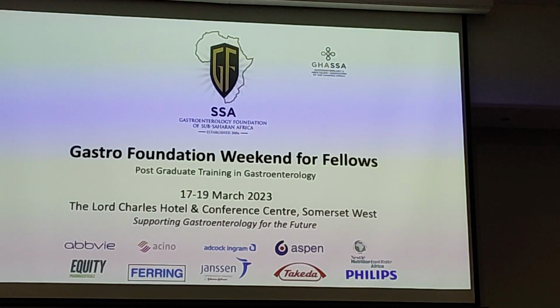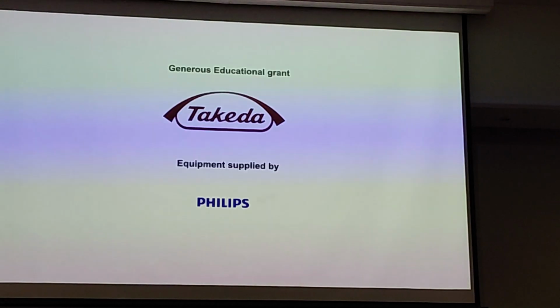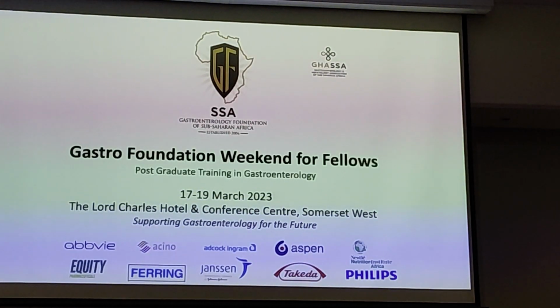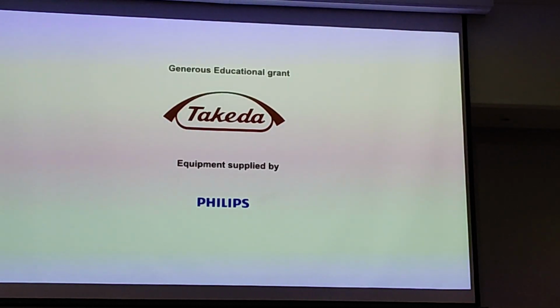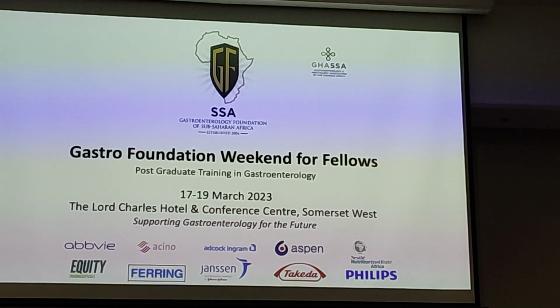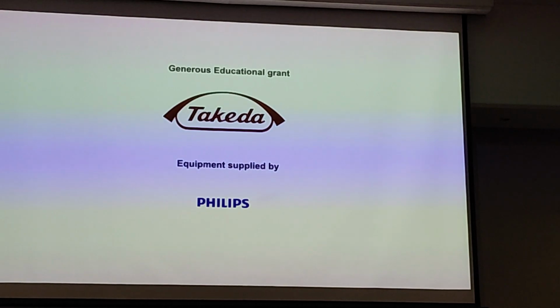And well, ECCO with the imaging guidelines has accepted ultrasound as a useful tool, and they also provide now those courses in intestinal ultrasound. You know that IBUS, Torsten Kucharzik and Christian Maaser have set up a huge program, also training people. So I think it's well accepted with ECCO as a diagnostic tool, and also reflected in guidelines that you can use it.